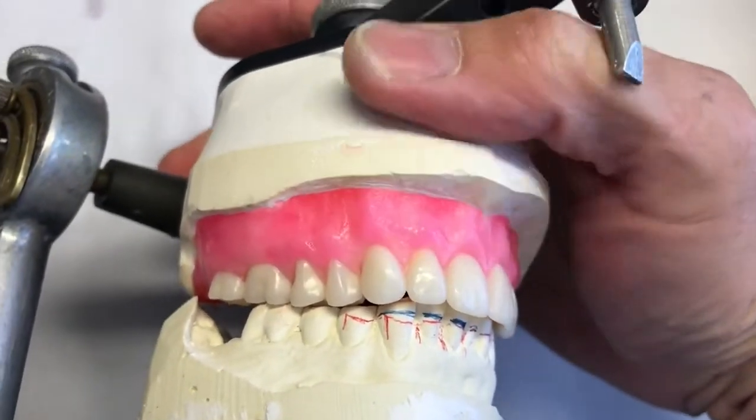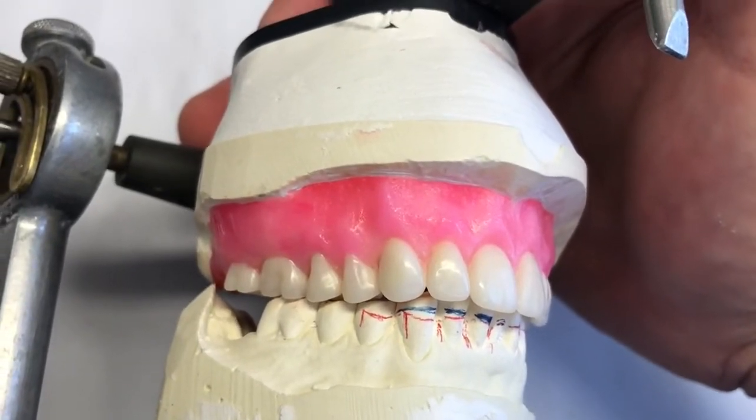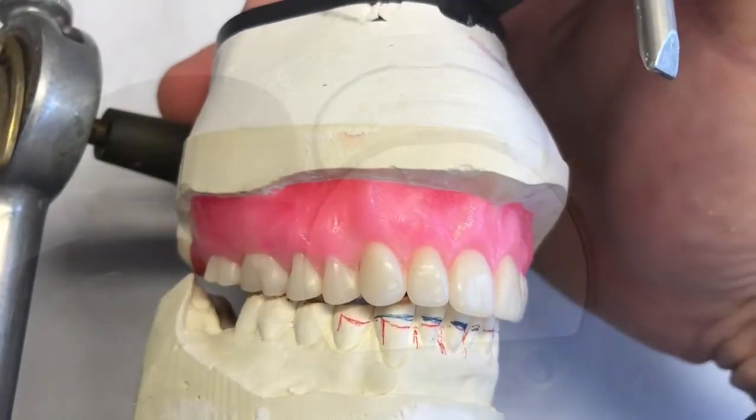Next I'll separate it from the mounting plaster, then flask it, boil it out, pack it, and duplicate it for a clear surgical guide.